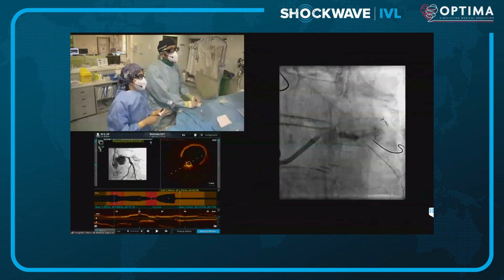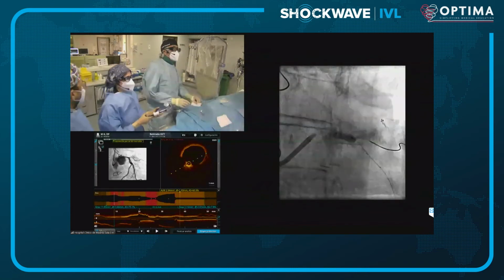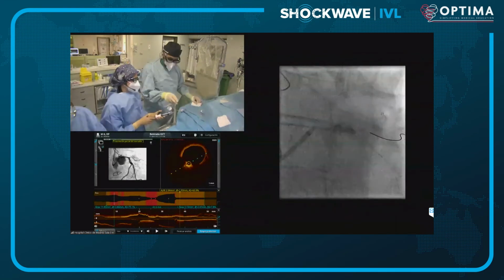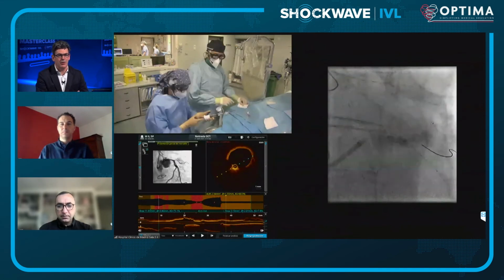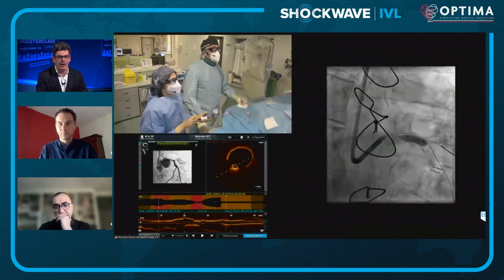So this is a non-compliant balloon, 14 atmospheres. It has really improved. Sometimes you just need that. I think Azeem has to go off to the cath lab soon. Azeem, what do you think now about this balloon expansion in the left main here?